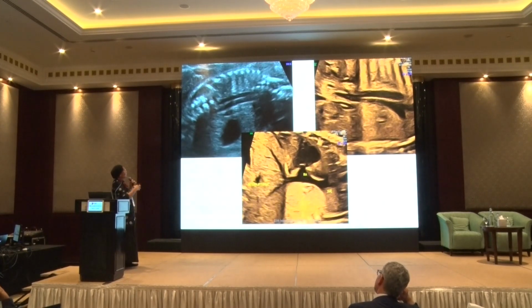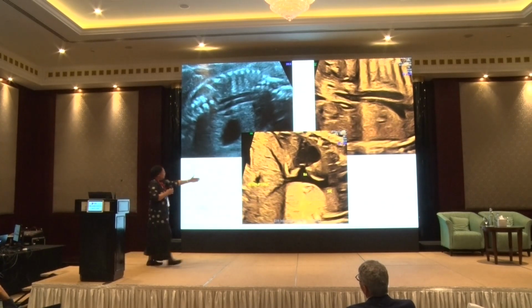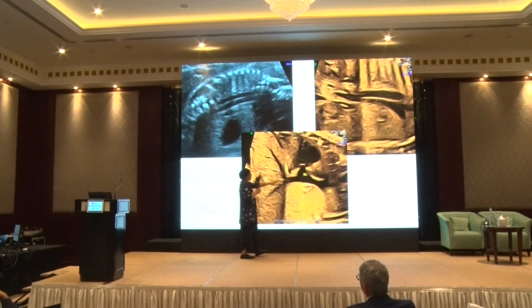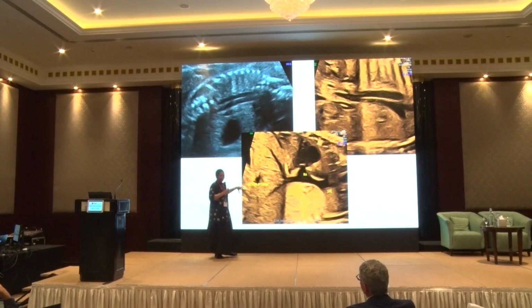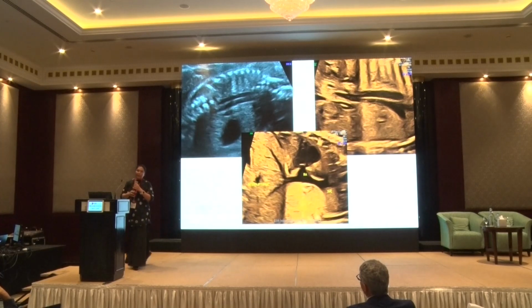And again, I did exactly the same thing what Suleiman was saying. Like, you have two vessels. Actually, only one vessel will be ascending up, which is the aorta, because the IVC will already enter the right atrium below the diaphragm. But here what's happening, this is the parasternal view that we have right atrium where the SVC is joining, and here there is no inferior vena cava. So this is an isolated interrupted IVC, which is sometimes known to happen.